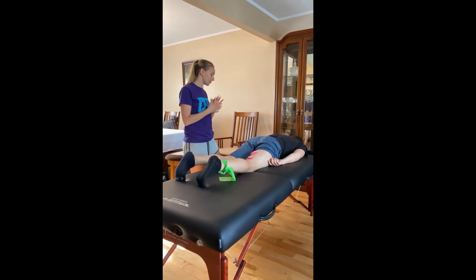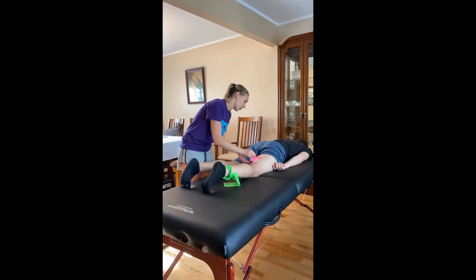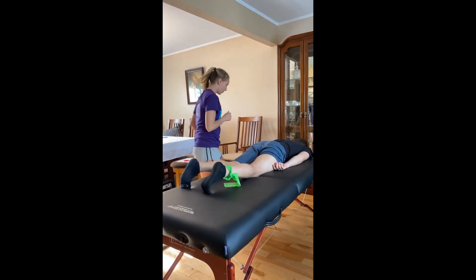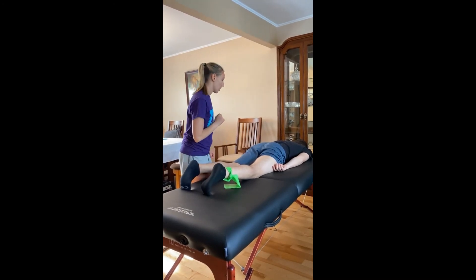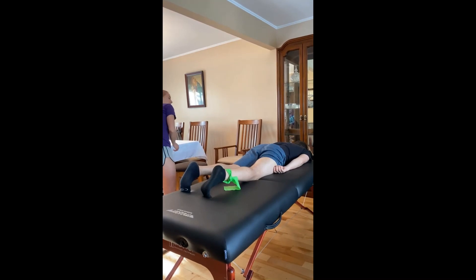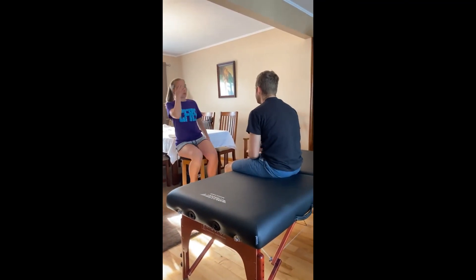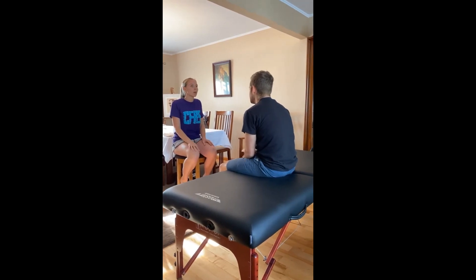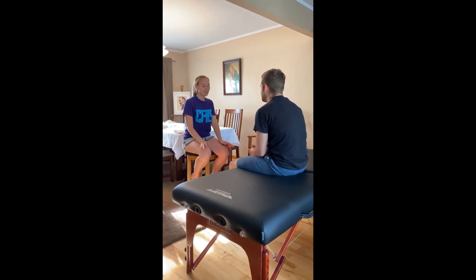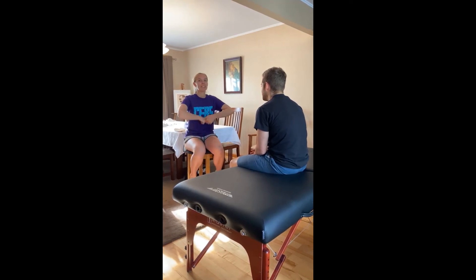20 minutes later, end of session. Everything looks good. I'm going to turn off the machine. Mr. Wealtel, I'm going to remove these electrodes from you. I'm going to double-check the skin — skin looks pretty good, nothing abnormal with muscle tone or skin integrity. Mr. Wealtel, do you want to come into a sitting position? How do you feel now on a scale of one to ten? About a four. Your pain decreased from a six to a four. Do you have any questions about IFC today? Any other goals? Just feel better. It looks like we have everything we need and we'll incorporate that for our next session.